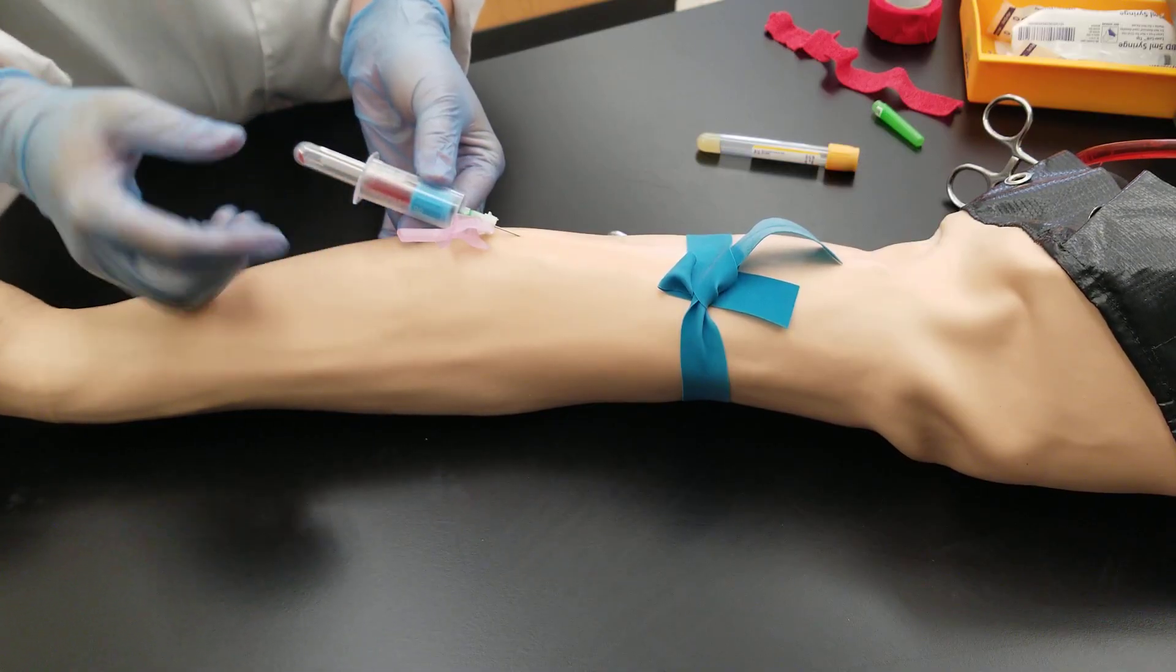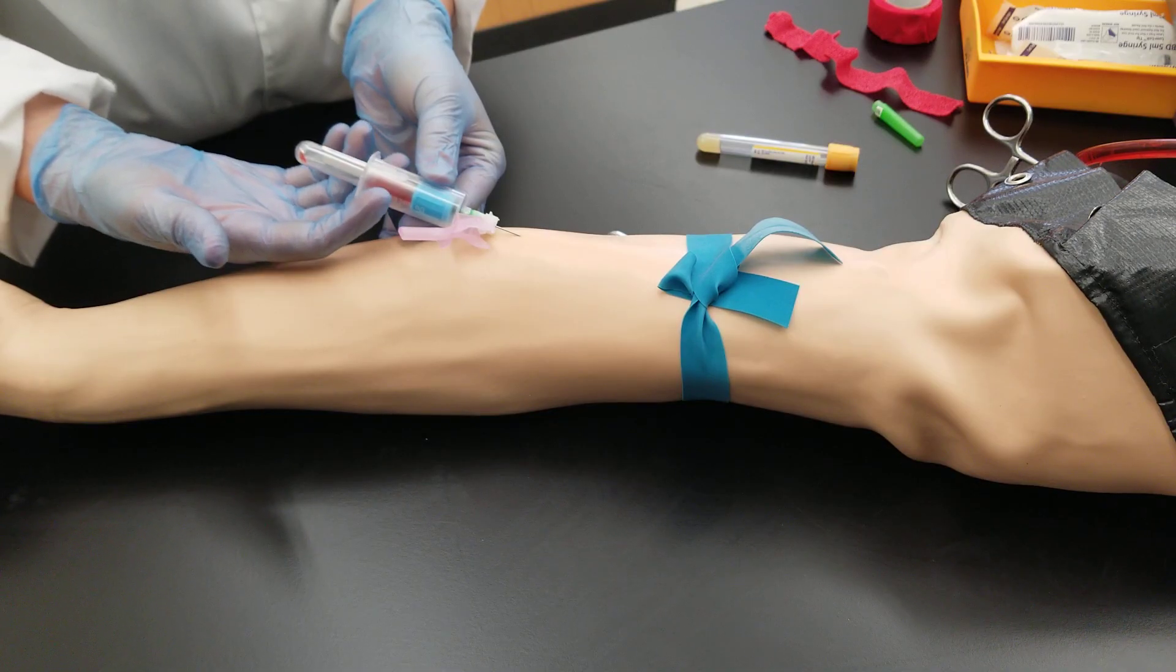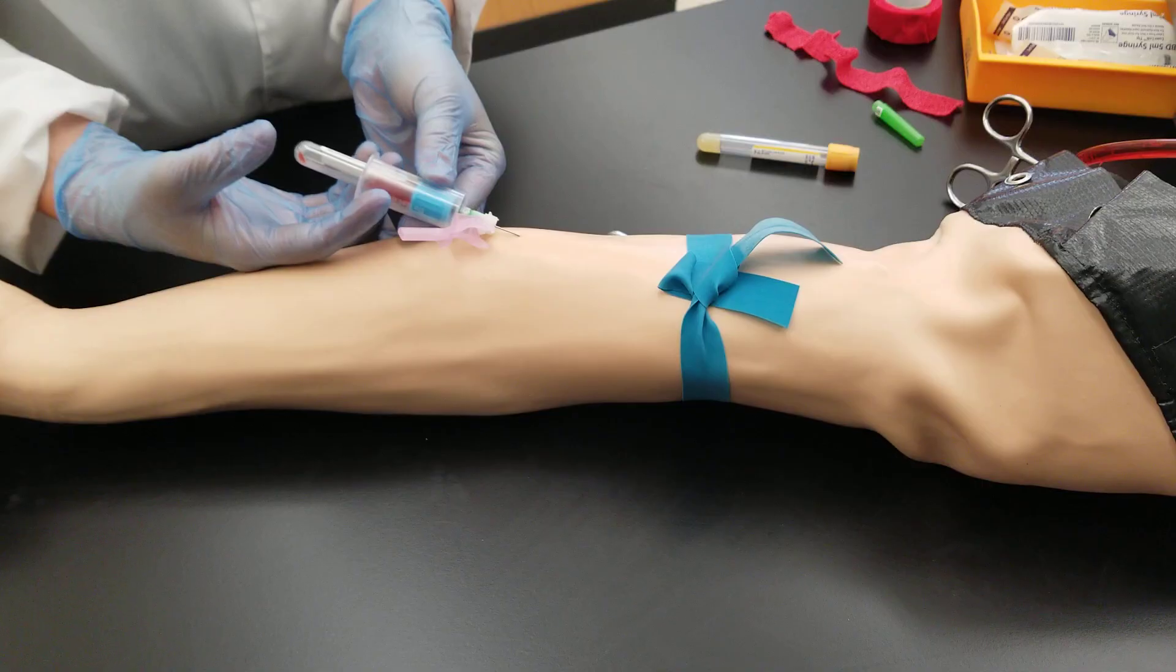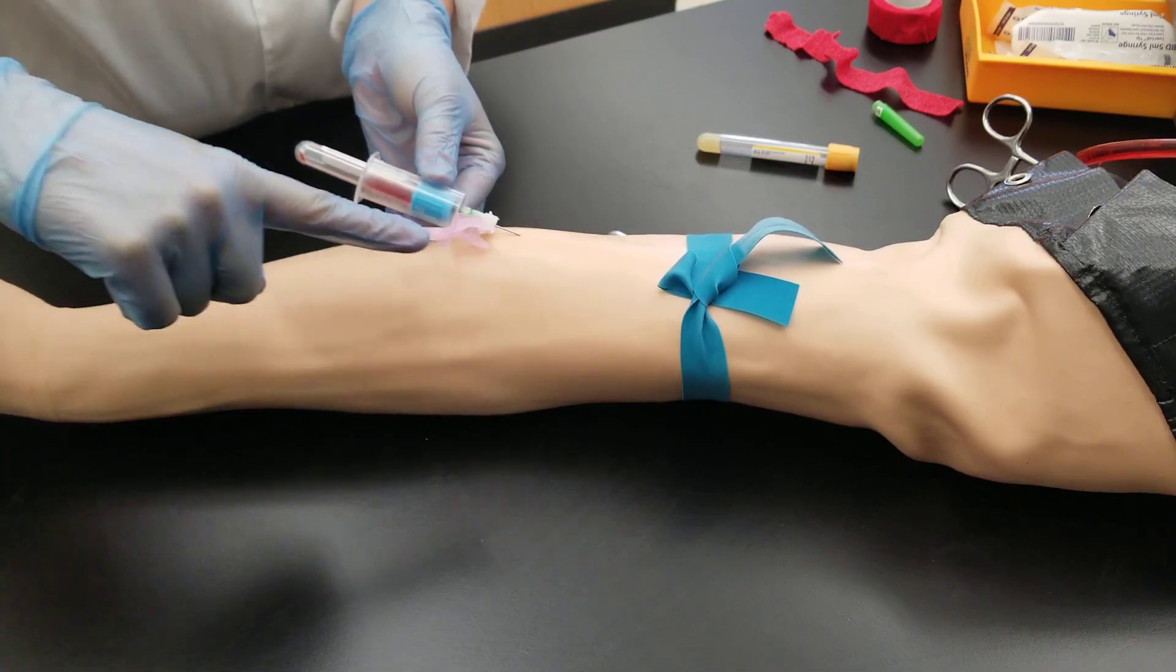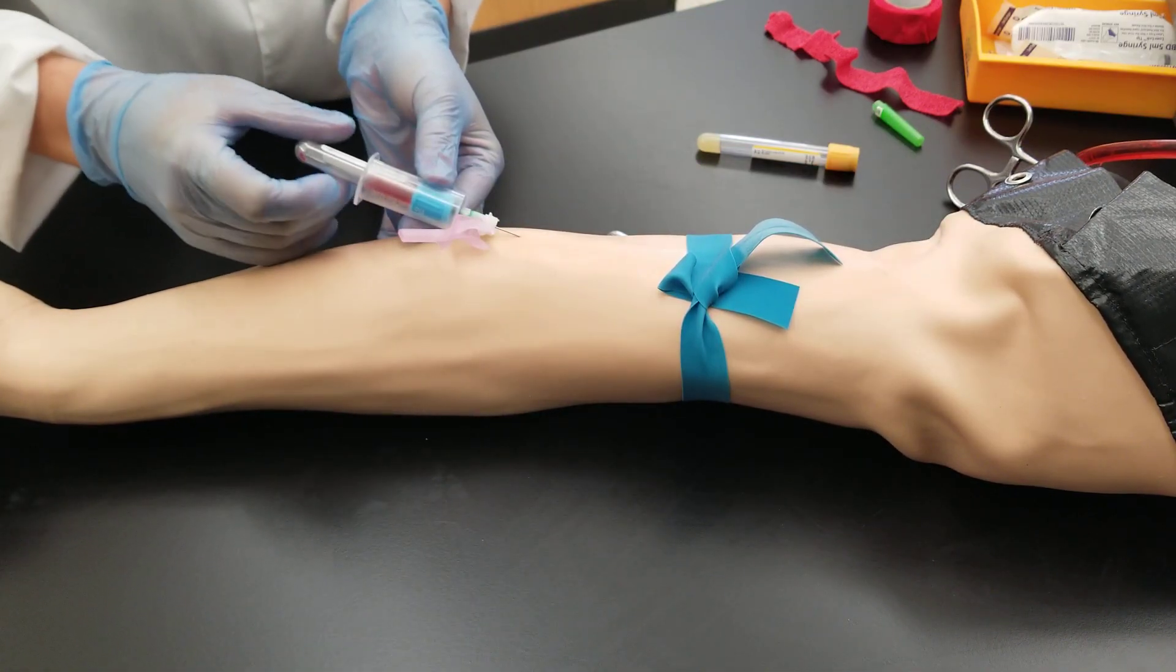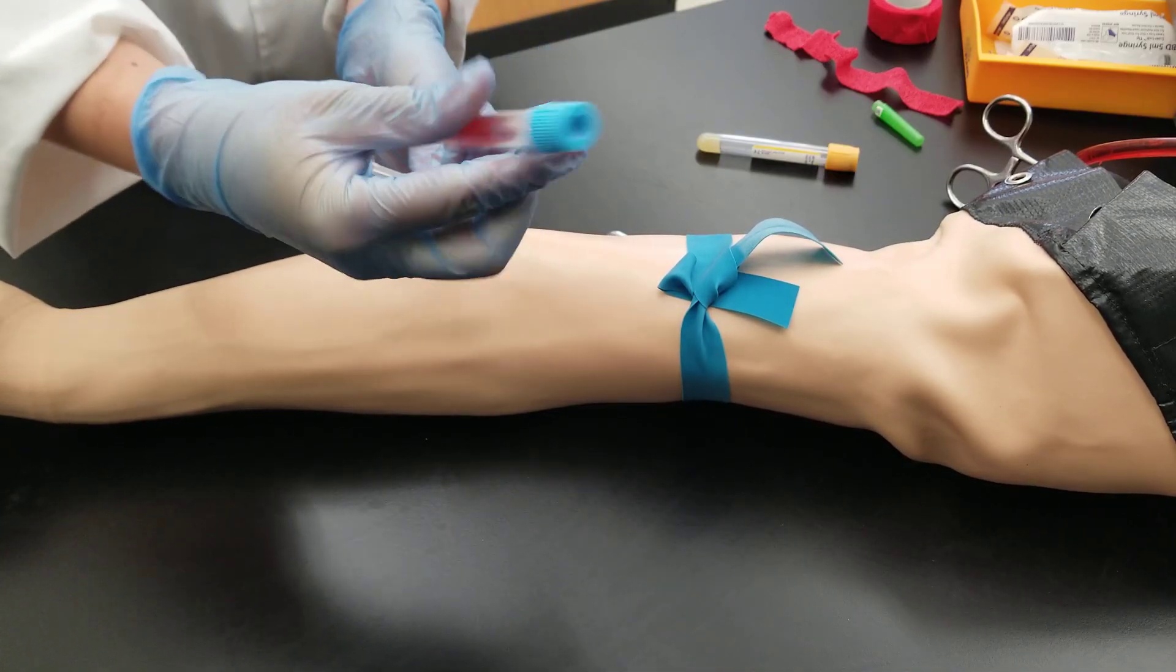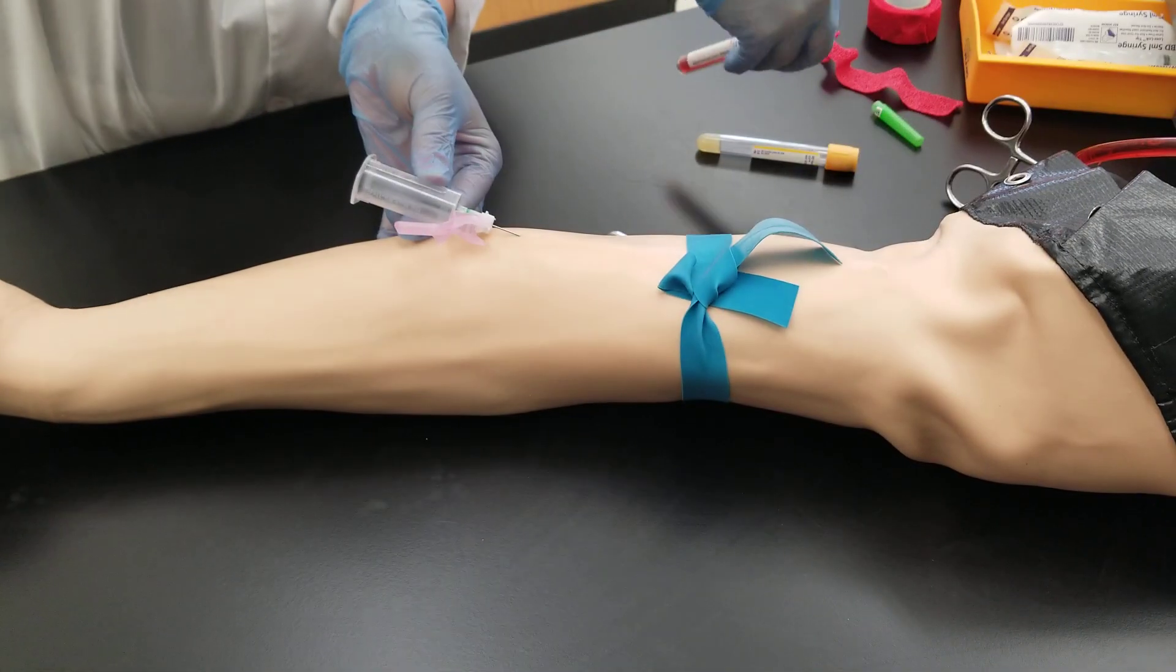I don't know if you noticed, but when I inserted this tube, I had my fingers on the holding parts of the hub. And I pulled that back. And I pressed the tube in with my thumb. That's so that I'm not jamming the patient with the needle when I do that. So I'm going to pull this out. And I have a short draw on that blue top. It's not at the etched area.